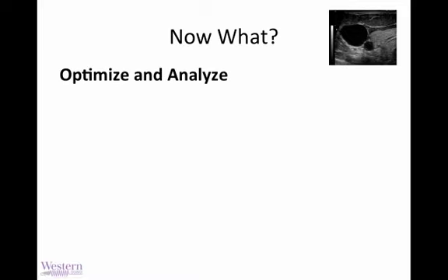So once you've got a basic image on the screen, you're going to optimize and analyze, of course.